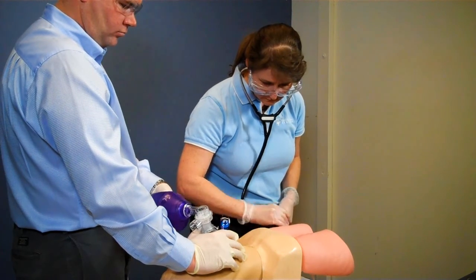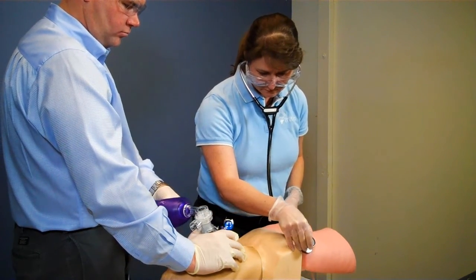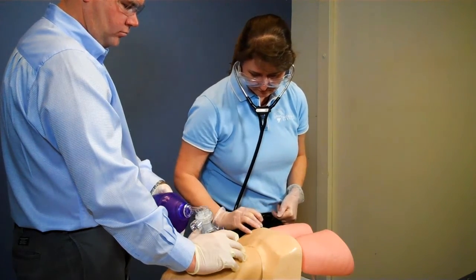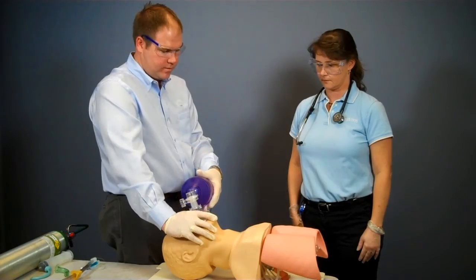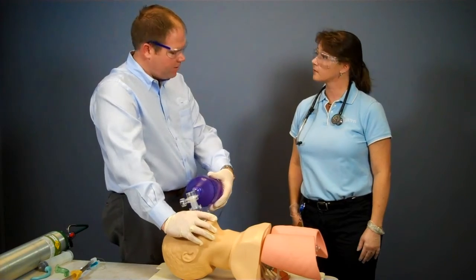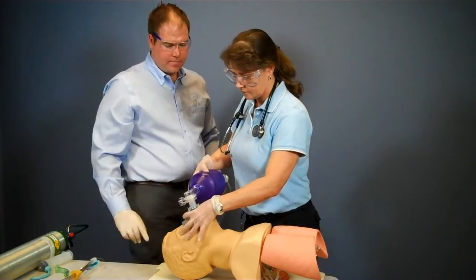After talking with medical control, I have been given permission to insert a supraglottic airway. To accomplish this, I direct my assistant to take over ventilations and I ask them to pre-oxygenate the patient.